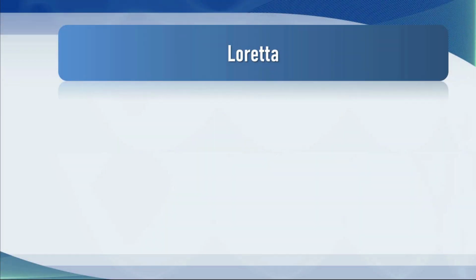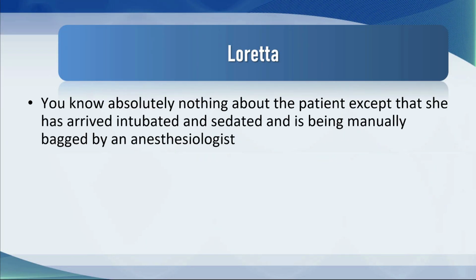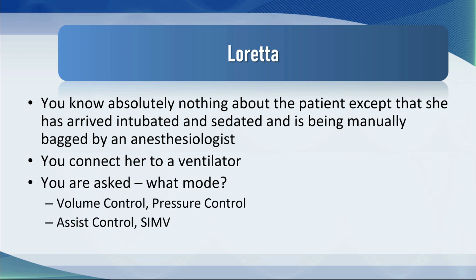A patient arrives in the ICU. Her name is Loretta, and you know absolutely nothing about the patient except that she has arrived intubated and sedated and is being manually bagged by an anesthesiologist. You connect her to a ventilator and you are asked, what mode? Volume control, pressure control, assist control, SIMV? Well, these are all conventional modes of ventilation.